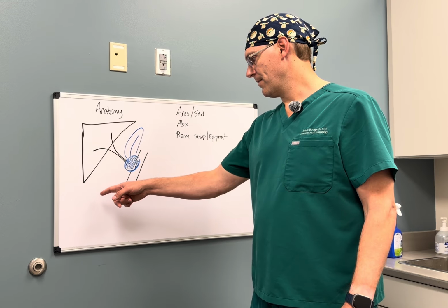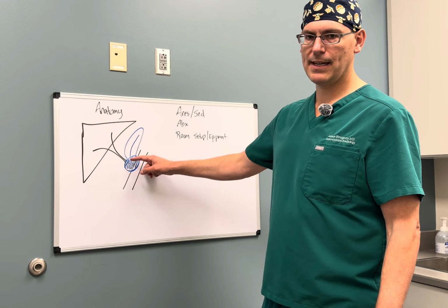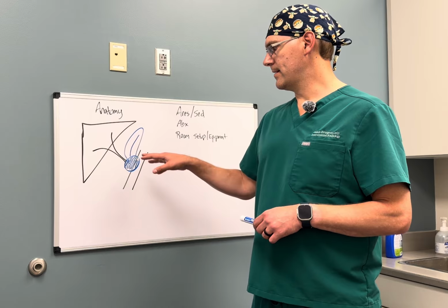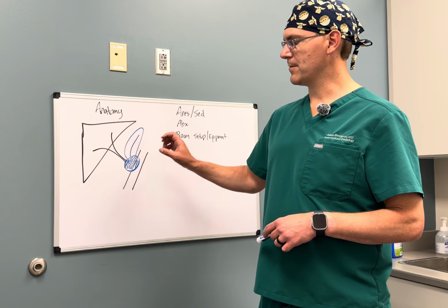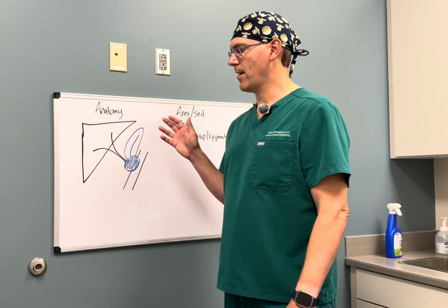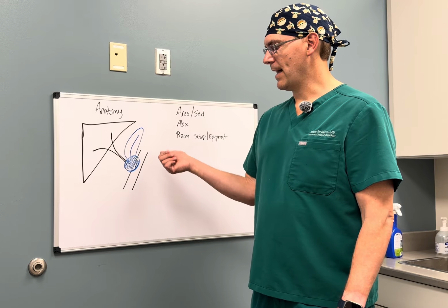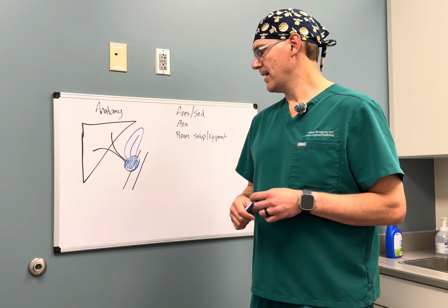It's also hard for an endoscopist to come in through the mouth, through the stomach, and into this area and be able to see and be oriented in order to cross this blockage and place a stent to decompress. And so this distal common duct, pancreatic head, ampullary region is one of the main reasons why we put drains in. When we do this, these drains are typically single drains, and they're mainly to give us access into the biliary tree to get a biopsy, put a stent, and leave a drain. Those are the three things we're trying to accomplish.